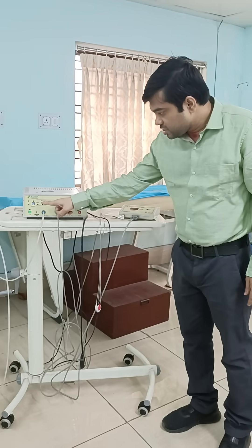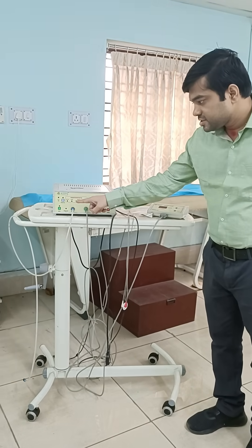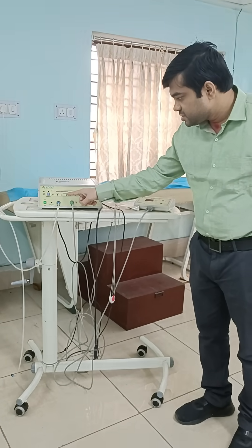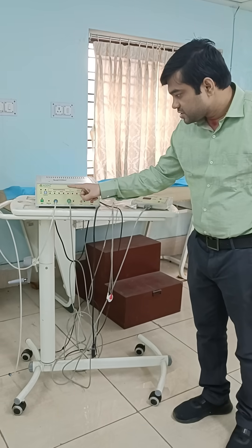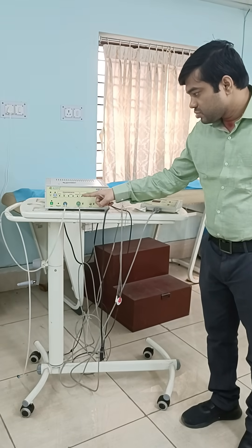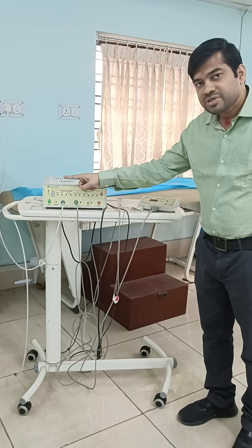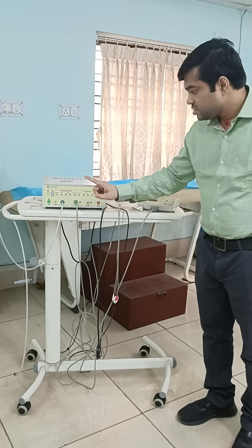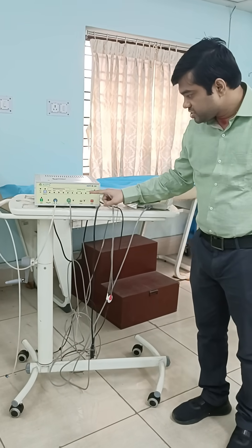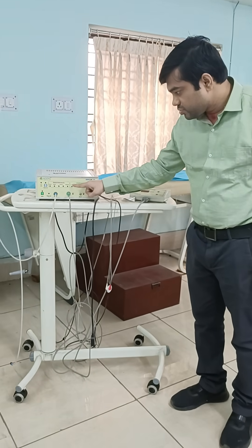We can find out the ECG at rest, ECG at deep breathing, ECG at standing, and ECG with Valsalva maneuver for parasympathetic function.